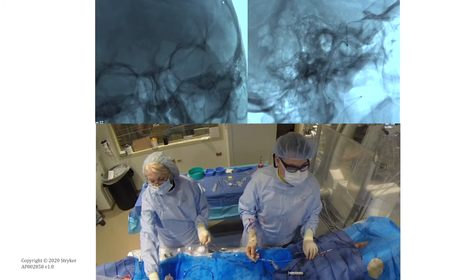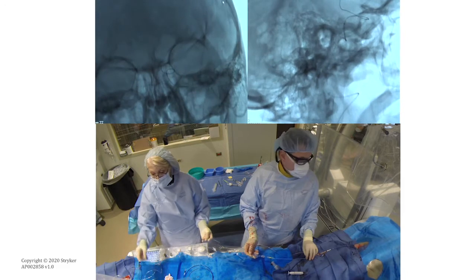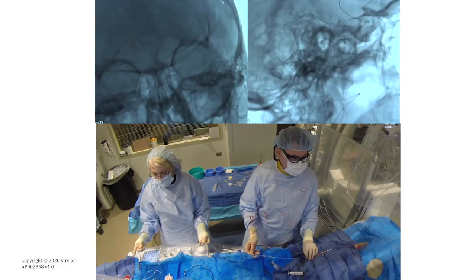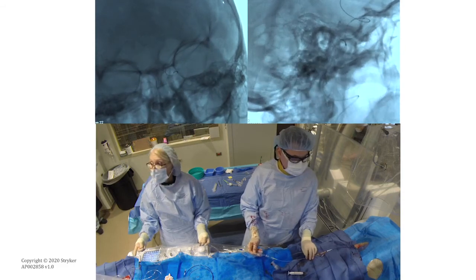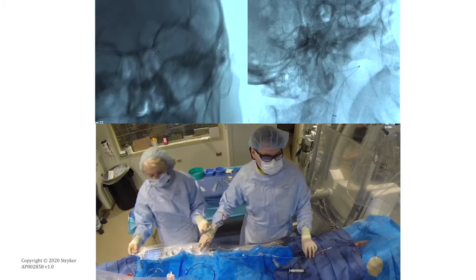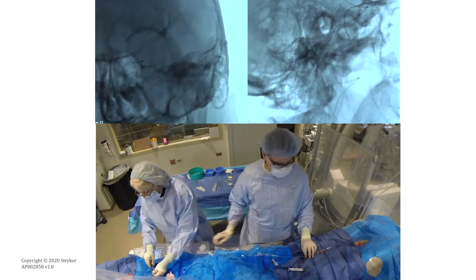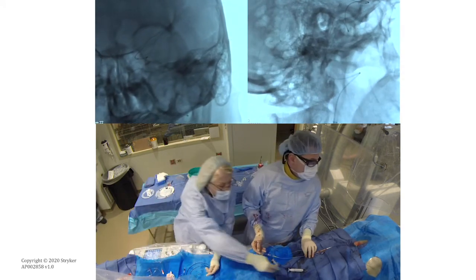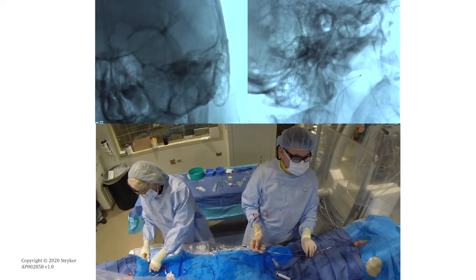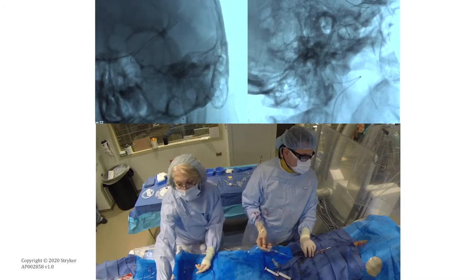I'm trying to find the best view here, as the patient in this case is not under general anesthesia, so the patient is awake and has some movements, as you can see. So you want to be very gentle with the wire in the distal anatomy, and once you have a position, always keep checking. You see here on the B plane, you have the position of your balloon guide in view, so you can see that it has been advanced into the internal carotid artery over the Trevo microcatheter and the Synchro Support wire without any difficulties.